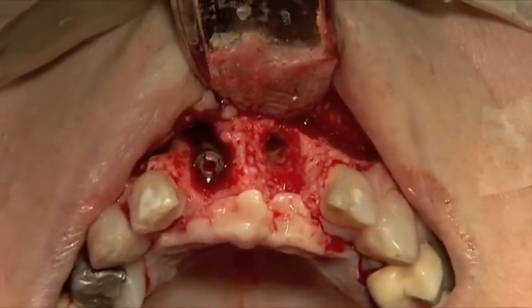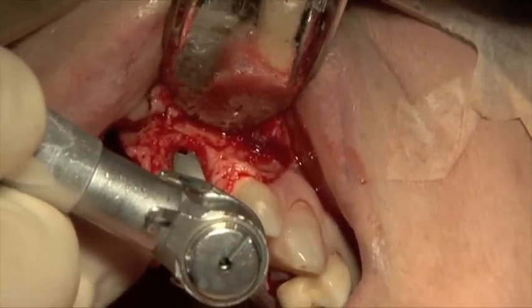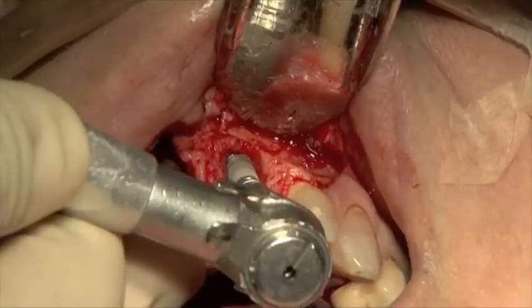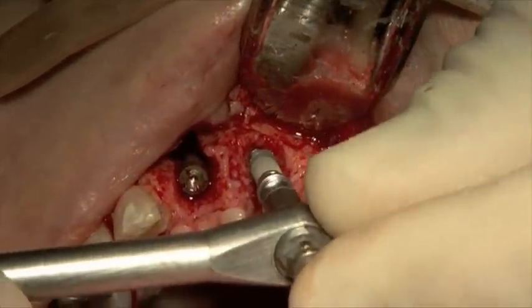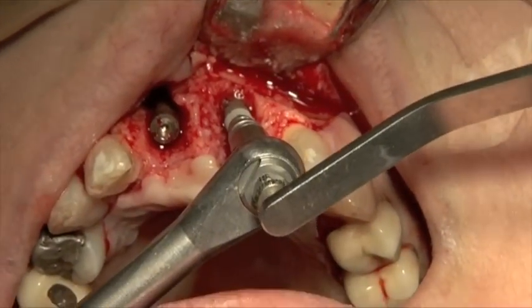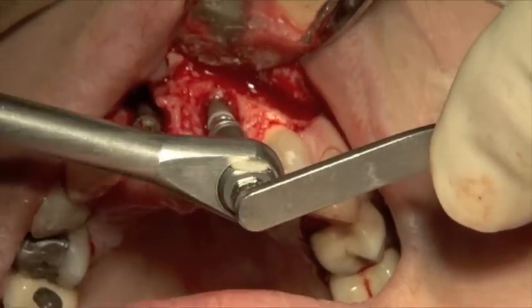It's actually there — okay, let's go, next one. Here I've already picked up 50 right up to there. So I'm going to change over to my hand piece.